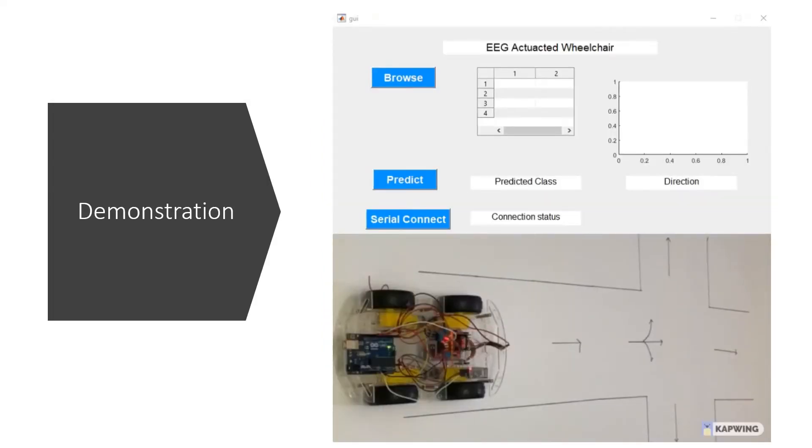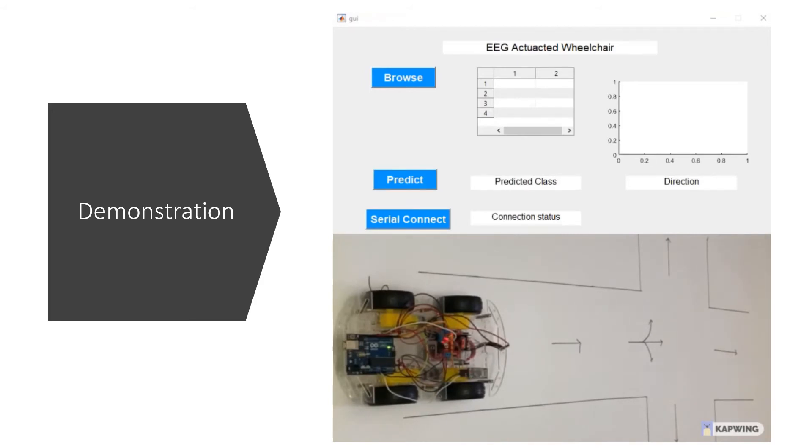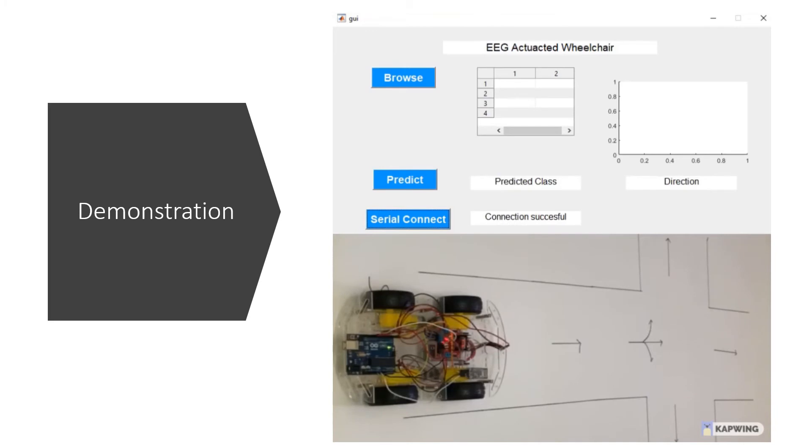This is the GUI for the EEG actuator wheelchair and the prototype of the wheelchair as well. First in the GUI, we can establish a connection between the MATLAB and the master Arduino circuit by using the serial connect. After the communication is established, it will show here connection successful. If the connection is not successful, it will say connection unsuccessful.